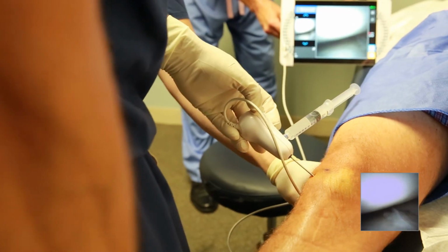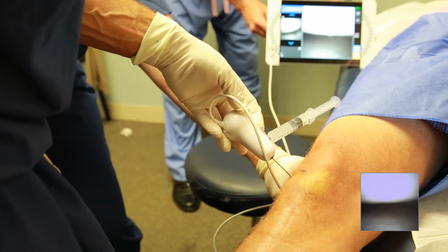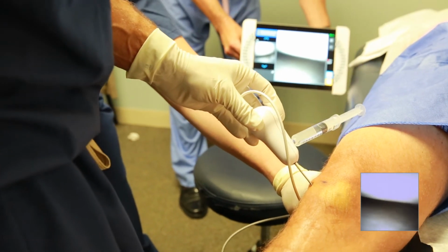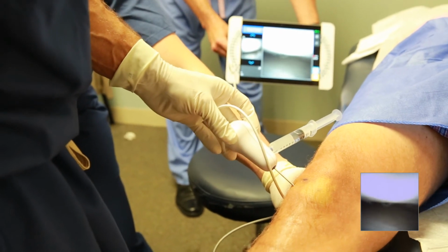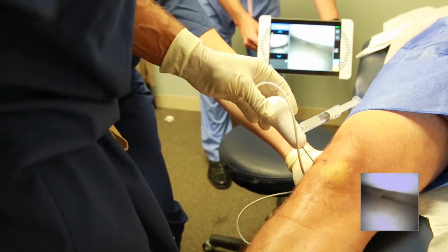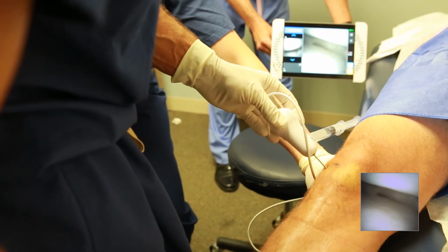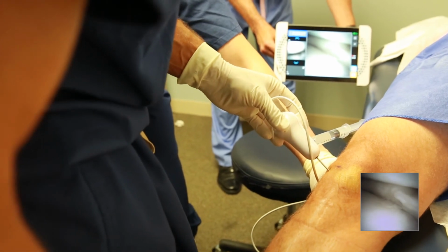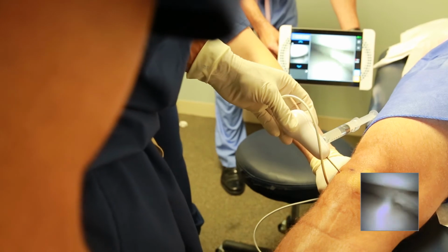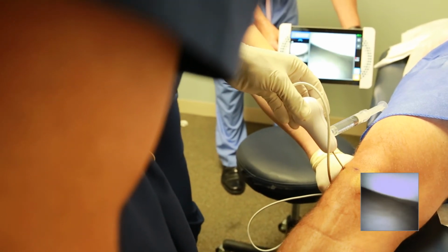Put your hand there, please, Regina. So you see we get a pretty good look at his meniscus coming from this direction. Lift that up. See, we're in the back. Your medial meniscus actually looks pretty good. It looks like what they did before worked. You have a little bit of meniscal tearing, but medial, you're doing well pain-wise.